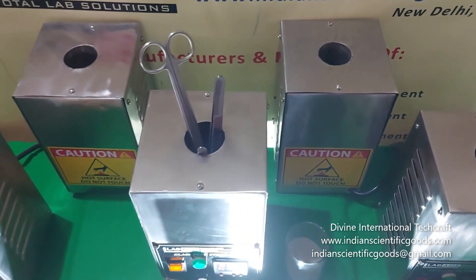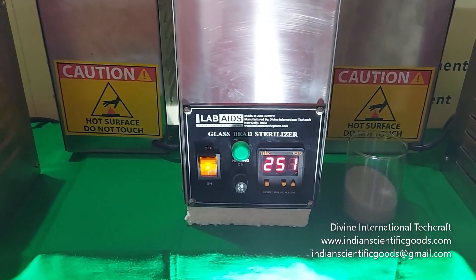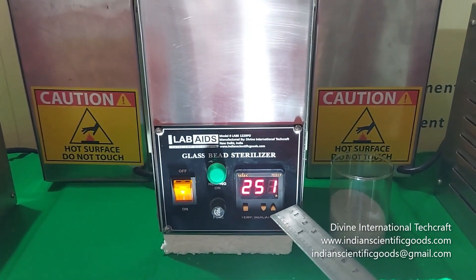Sterilizers with smaller and bigger crucibles are also available. The sterilization temperature can be set from 100 to 275 degrees centigrade using the digital temperature controller cum indicator.